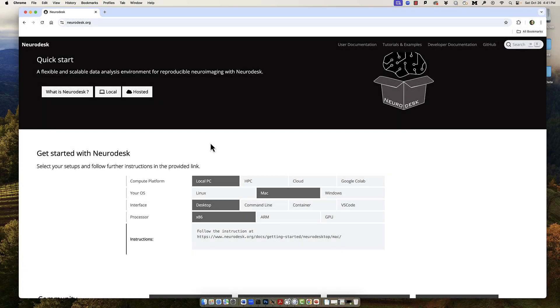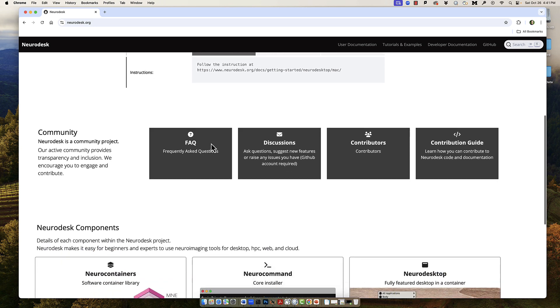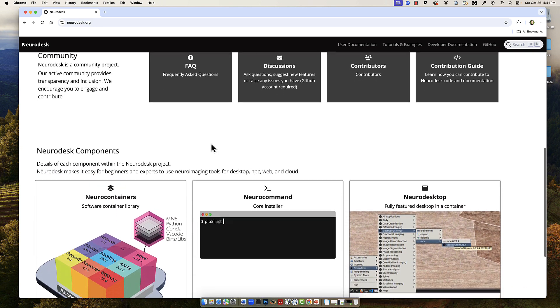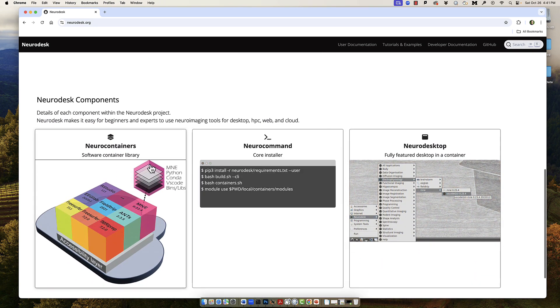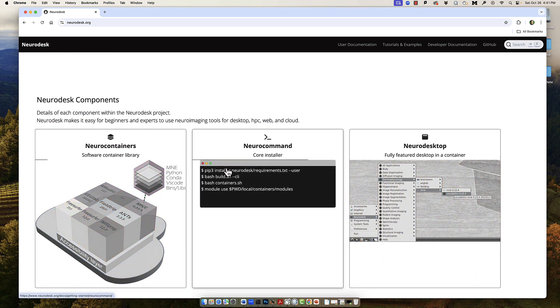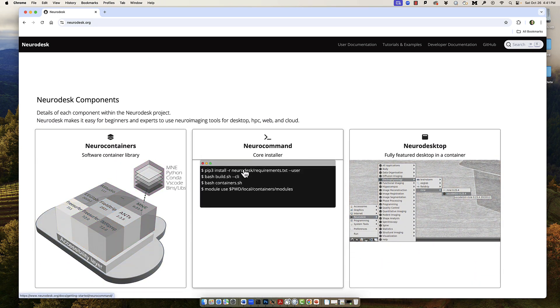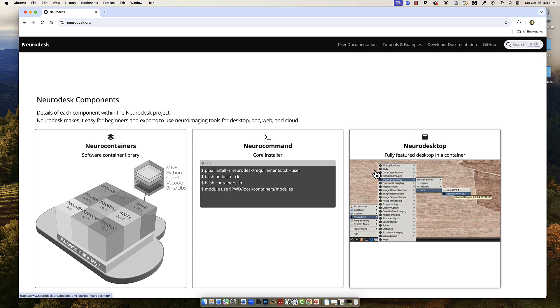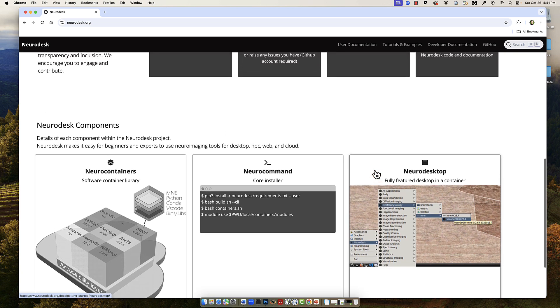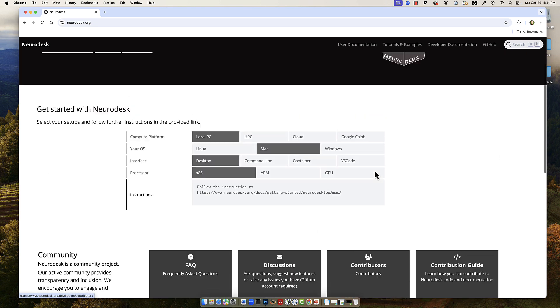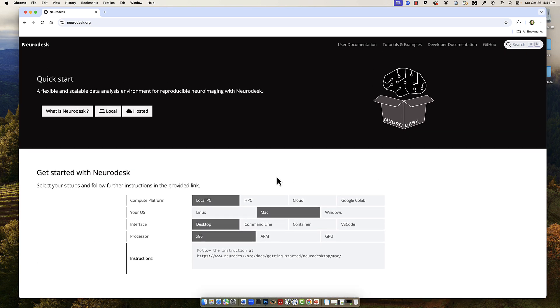Let's take a look at the Neurodesk website, which can be found at neurodesk.org. They have many useful tutorials and guides which I encourage you to read. For now, though, we will download the Neurodesk app.